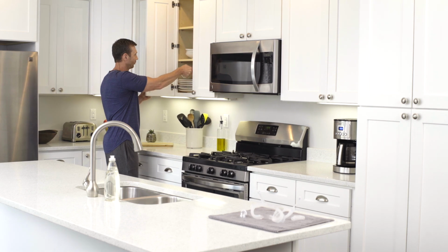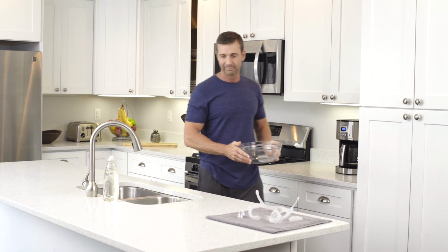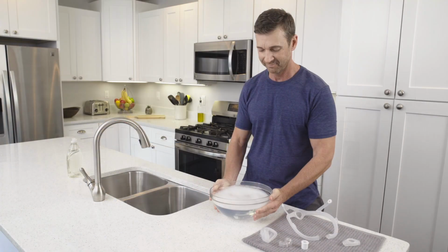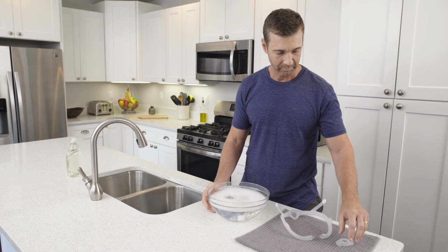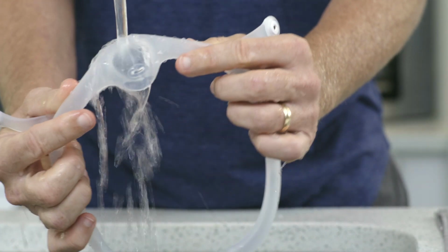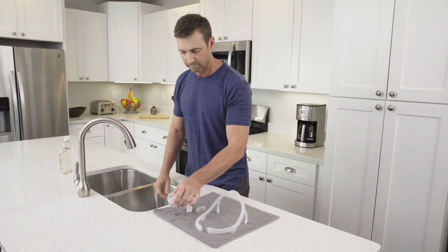Hand wash the non-fabric parts, the mask cushion, mask frame, elbow, frame size connector, and tubing quick release, daily using mild liquid dishwashing detergent. Submerge the parts and examine them to make sure there are no air pockets present. Rinse the clean parts thoroughly with water. Let them dry completely before use.